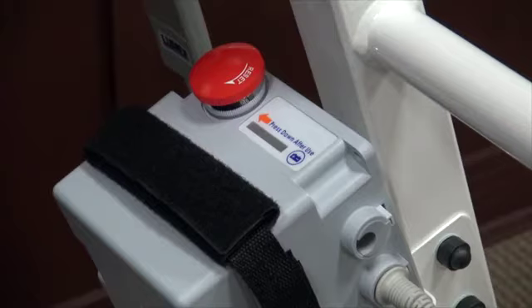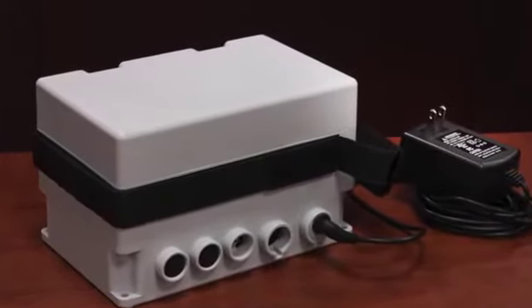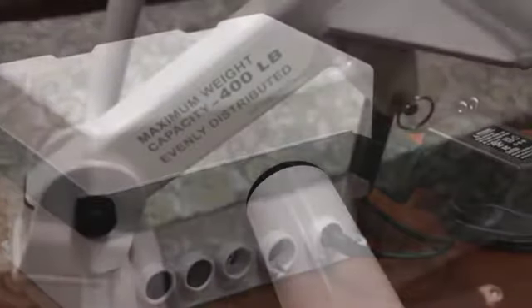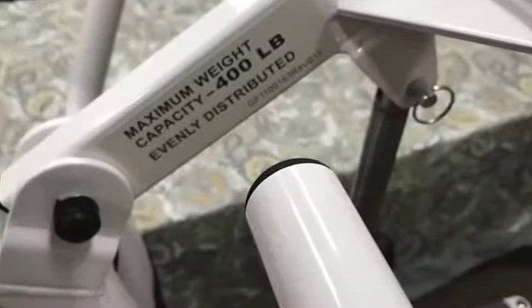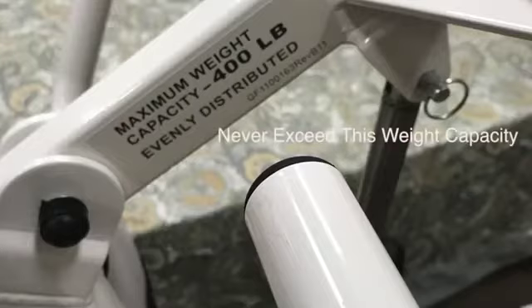Unplug the charger before operating the lift. The LF 2020 and LF 2090 will not operate while charging. When the battery is fully charged, the red button should be placed in the down position when not in use to prevent the battery from draining. Many customers like to buy an extra control box and batteries to have a fully charged unit on hand.